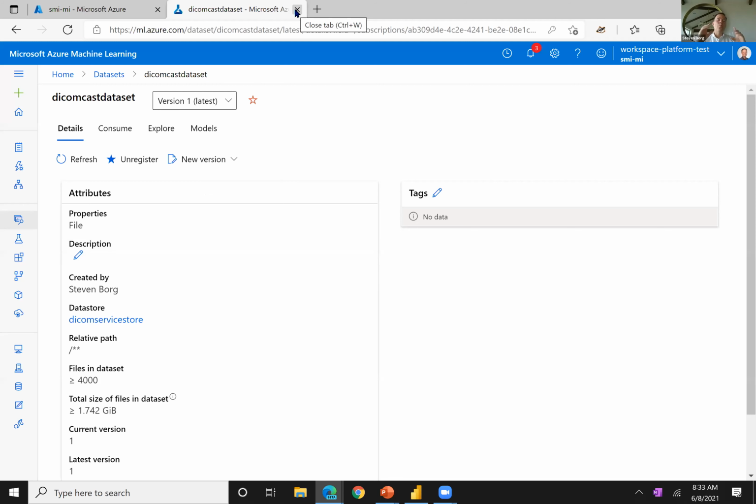So the point is, as you are extracting this data from FHIR and DICOM, you can start to slice the data in FHIR, pull the data you want, the data that you believe you need to run a machine learning model through. Now go get the data from DICOM, pull that data in, and run a machine learning model against it. Additionally, you could create cohorts.